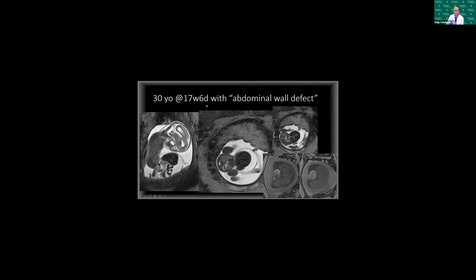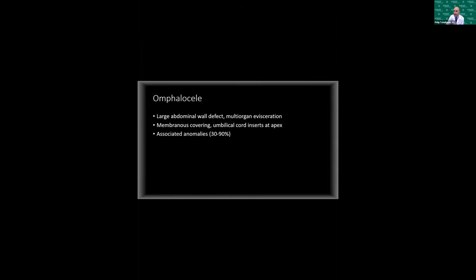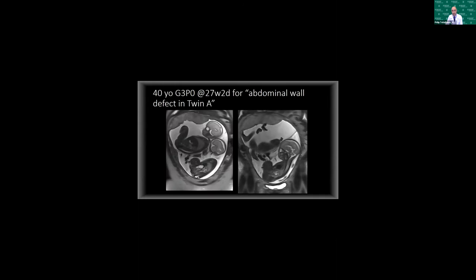Another case of an abdominal wall defect, imaged very early at 17 weeks: all abdominal contents are externalized. We can see the liver externalized, and on T1 weighted images we can show that the liver — bright on T1 — is external to the fetal abdomen, along with meconium-containing bowel loops externalized as well. This is a classic case of an omphalocele, moving up in the degrees of severity of abdominal wall defects.